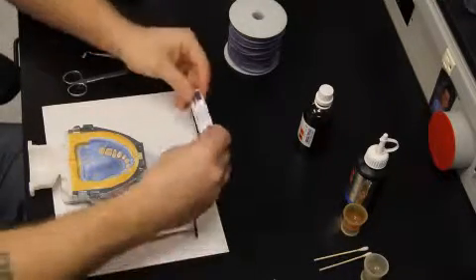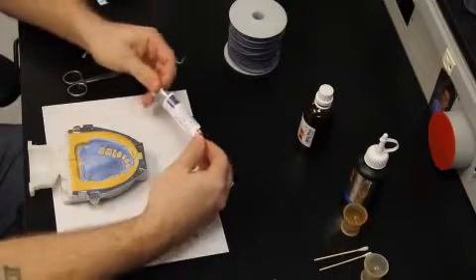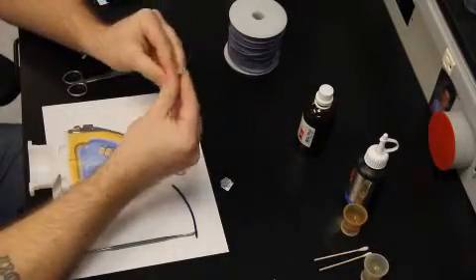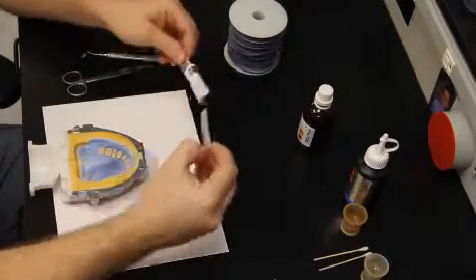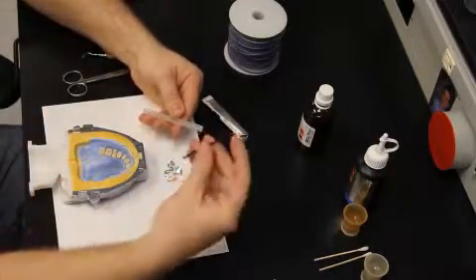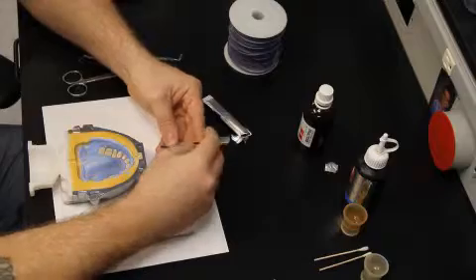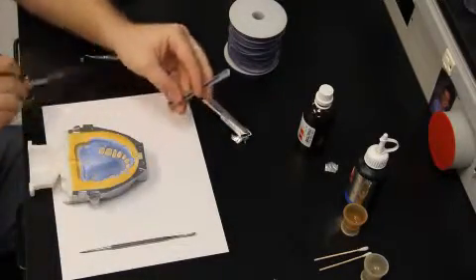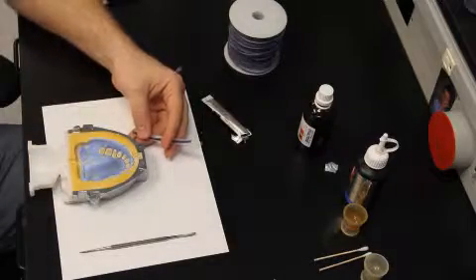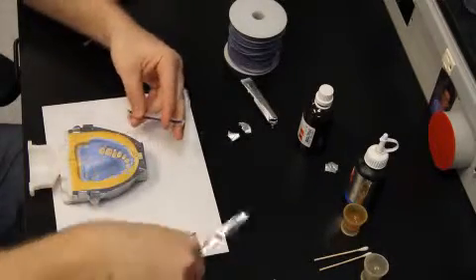Now what I'm going to do is open up the E-Fiber from Preat. Comes in this little carrier. I love this product because it is sticky and it's easy to manipulate. But it is quite difficult to cut once it's in there. So that's the reason I use the rope wax to give me my length. So I go ahead, I stick my rope wax on the E-Fiber, and you can see I'm using almost all of it, but I'm going to cut it off right there. If we didn't do this and it was hanging over the back of the teeth, to get these scissors in here and cut it off, it's a bear. So the easiest way to do it is grab your rope wax, cut it off to length.